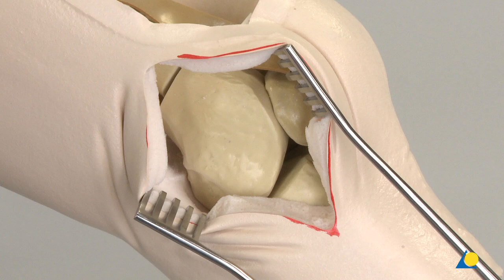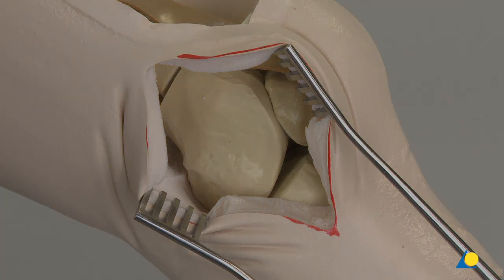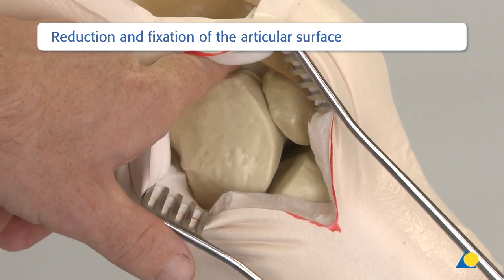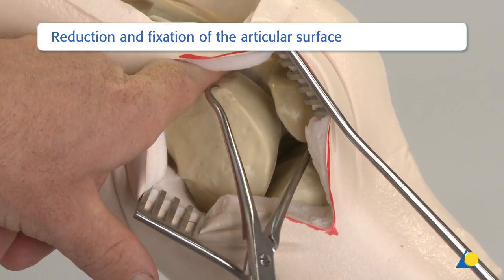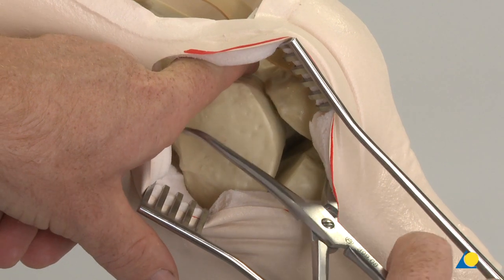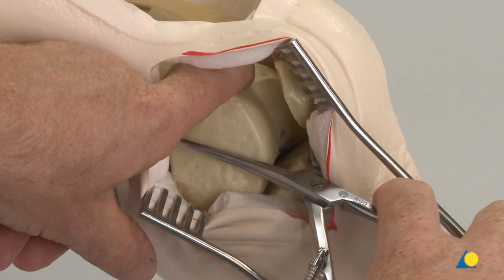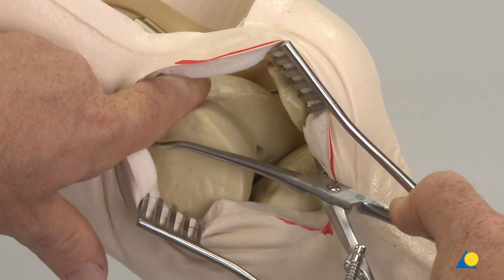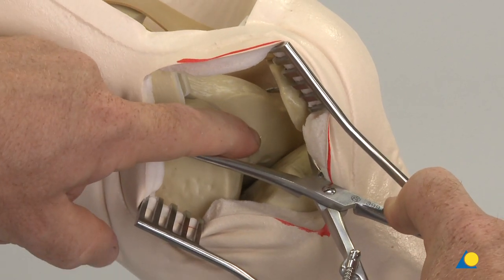The soft tissue is held open with the spreader. The large pointed reduction forceps are used to reduce the joint block. The reduction must be checked under image intensification.